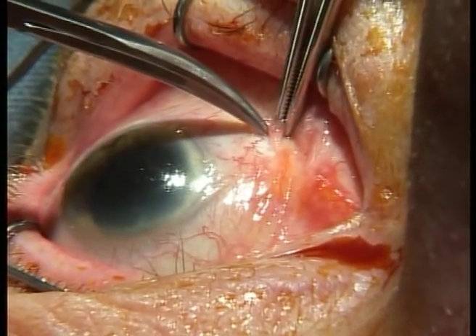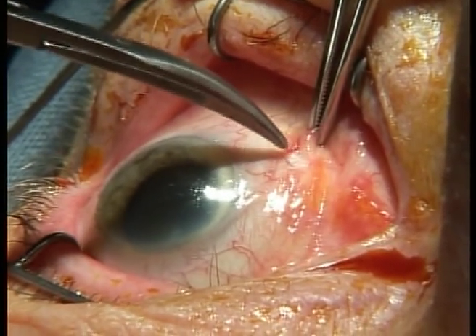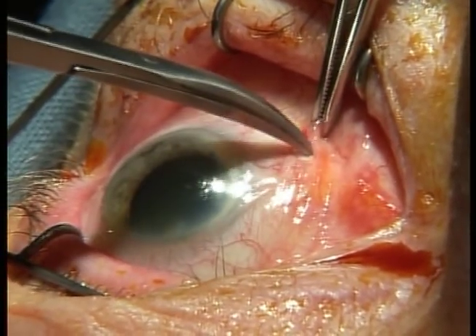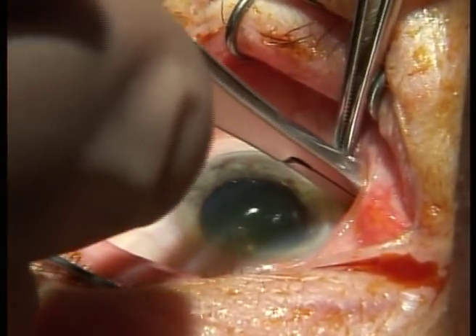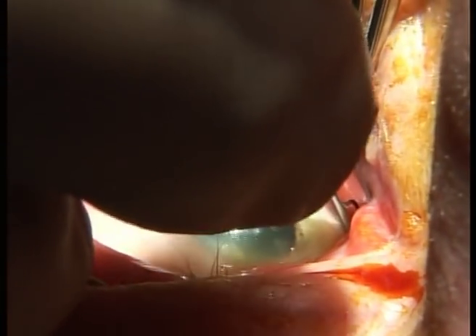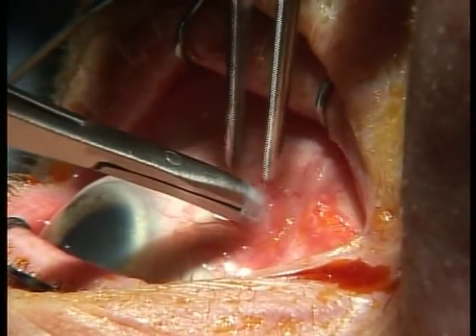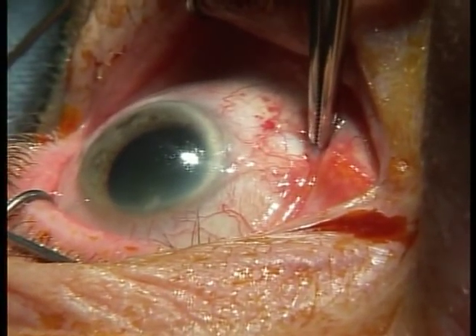We can see now the white of the eye is much whiter when you see sclera with no overlying conjunctiva. So this little patch here is bare sclera compared to out here, which is sclera covered by conjunctiva. So now I go into this layer with the scissors closed at all times and dissect around posteriorly, and there I just felt a little bit of loss of resistance as I passed through the adhesions at the equator of the globe.